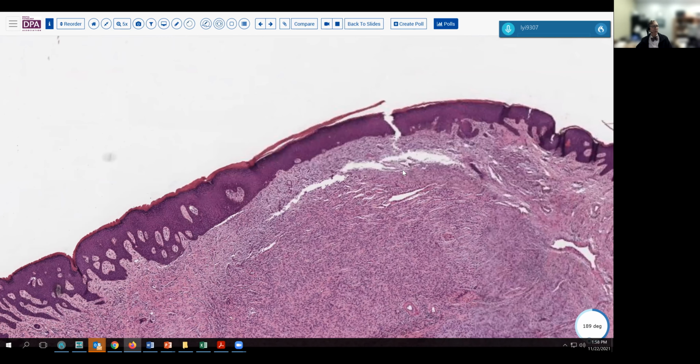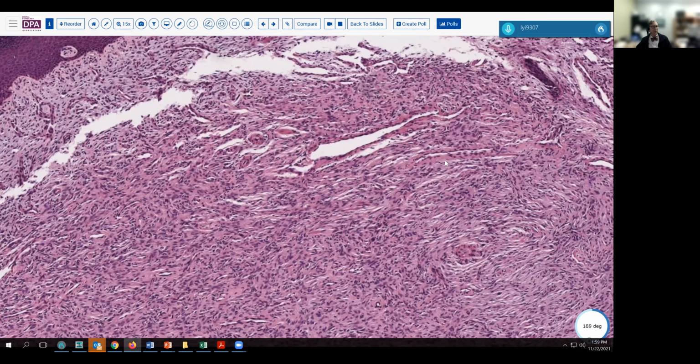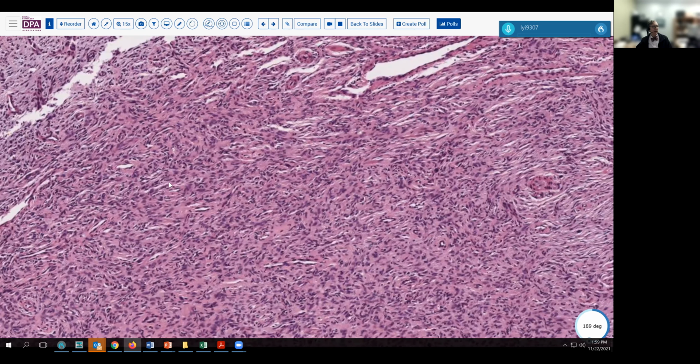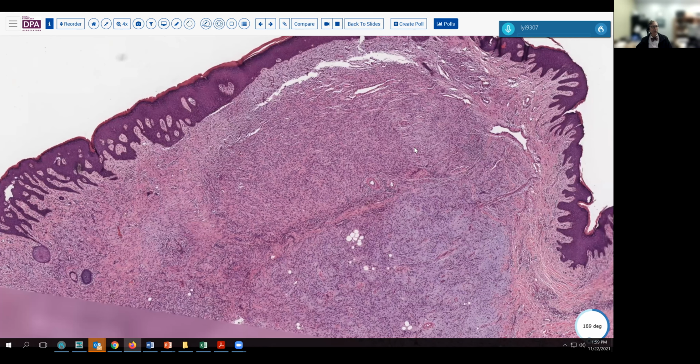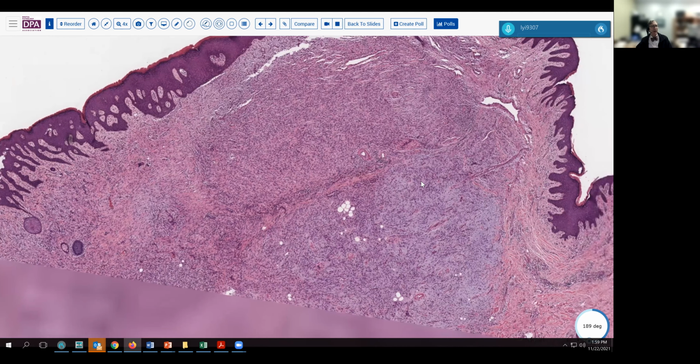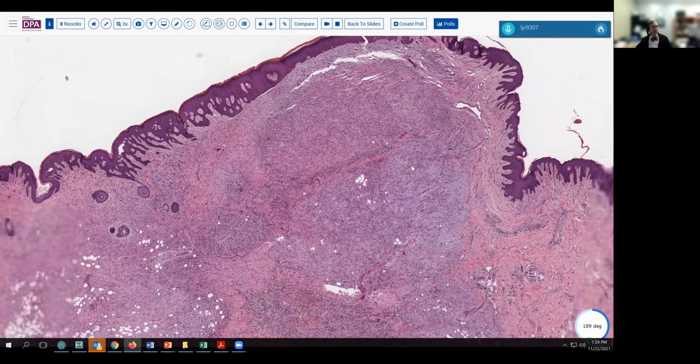Notably, dermatofibromas are remarkable for this change of an epidermal hyperplasia, and even on occasion can develop little basal cell carcinomas in this overlying epidermis that can be a cause for mistaken identity of these tumors. So a nice example of dermatofibrosarcoma protuberans. This was a case occurring in the vulva, not a very common location, but hence it's crossing my desk because it was managed by a GYN oncologist.